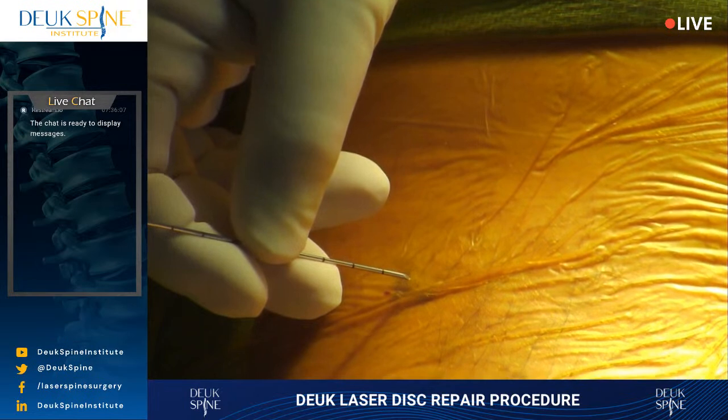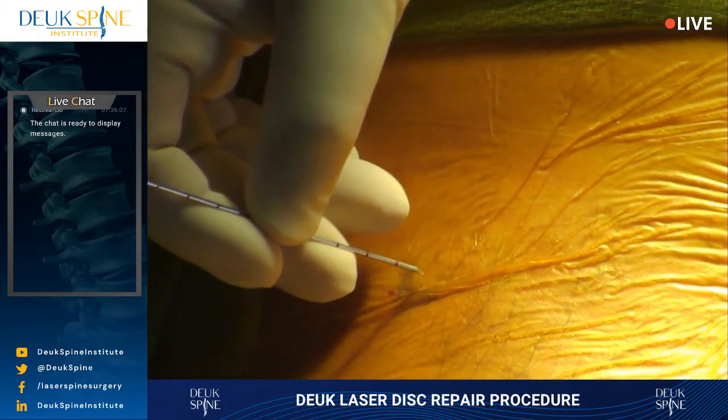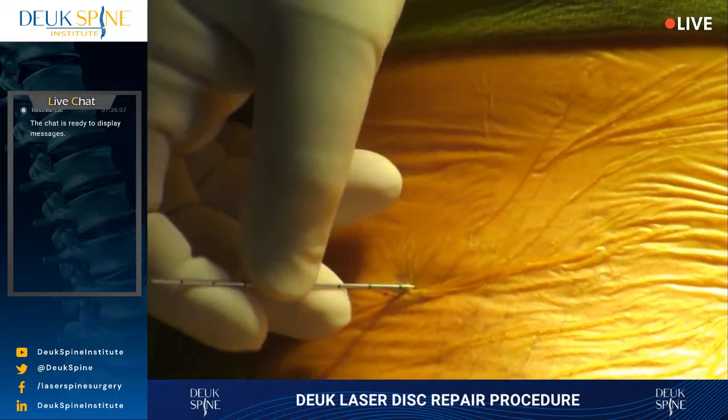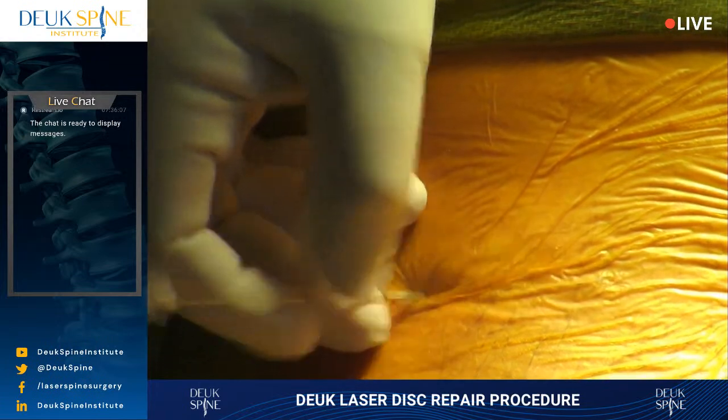So this surgery is very good at preserving the muscles, which are very important because the muscles are the source of everyone's pain after surgery.